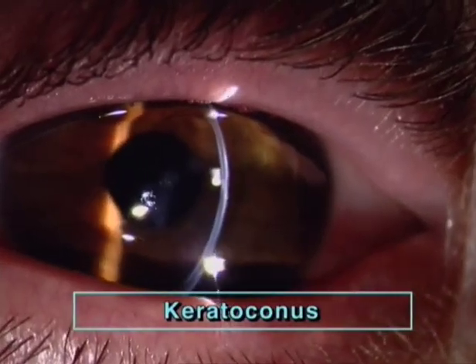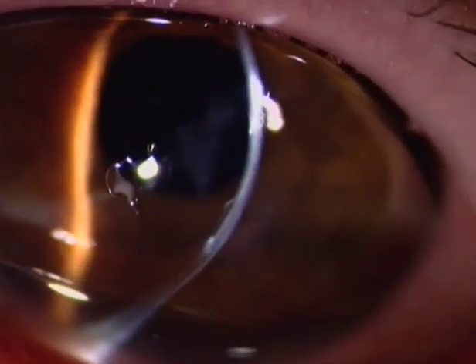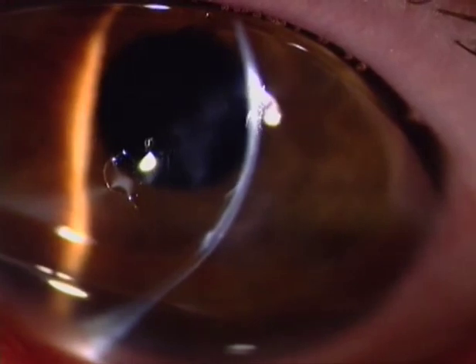In this case of keratoconus, we find a rupture of Descemet's membrane with a detached lamella. The rupture is seen here with the contact glass in retroillumination, with the detached lamella here scanned with the narrow slit.